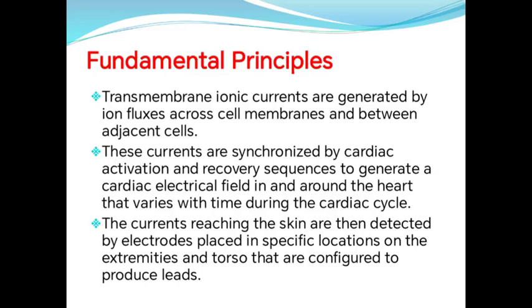The currents reaching the skin are then detected by electrodes placed in specific locations on the extremities and torso that are configured to produce leads.